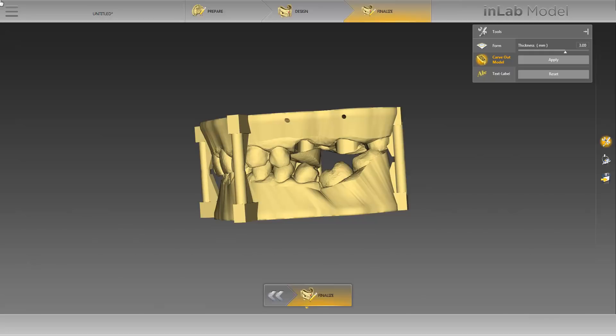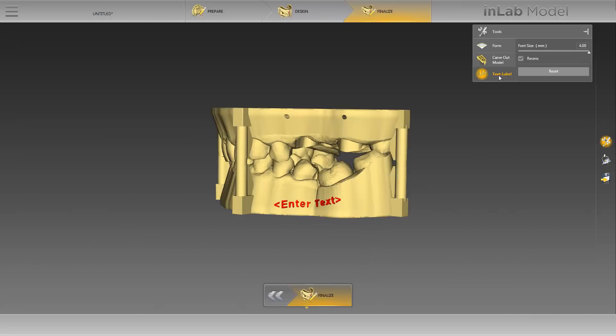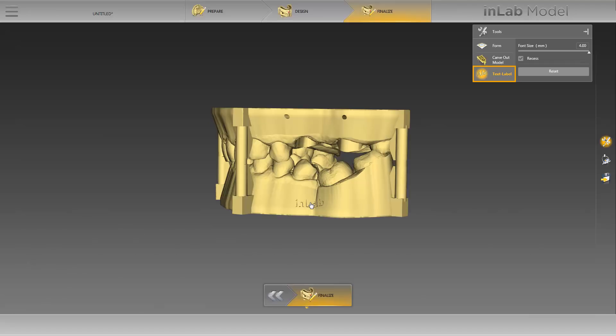Next, we will switch to the tool text label. Adding a text label ensures that the finished model can be assigned to a patient. By placing a check mark in the recess field, the added text is recessed. When the check mark is removed, the text is applied on the model. We move the cursor to our model and write InLab on the base of the lower jaw. Before we continue, we will deactivate our tool first to avoid accidentally placing further text on the model.